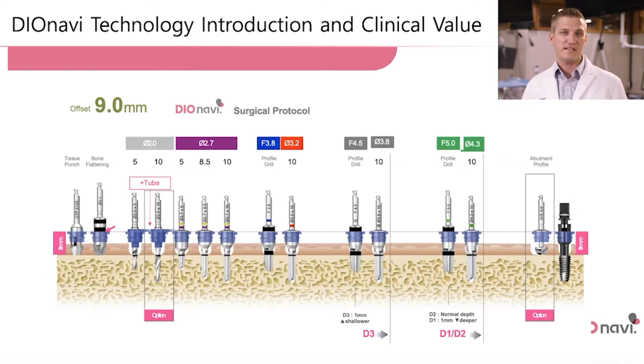Another thing I really like with DIOnavi is their drilling protocols. They'll show up on a sheet just like this, and this sheet just makes it seamless and easy to understand what the protocol is. Not in words, but in pictures. Anyone can read it, anyone can understand it. It makes it even easier for me as a clinician to be there and to see exactly what the drilling protocol is going to look like.